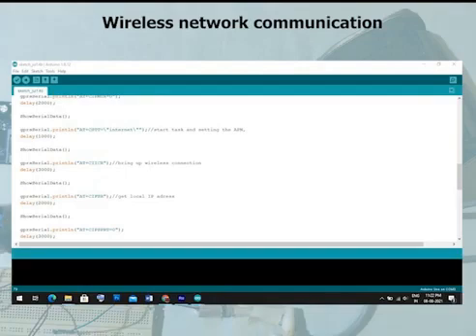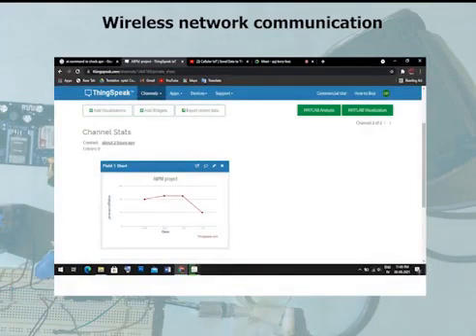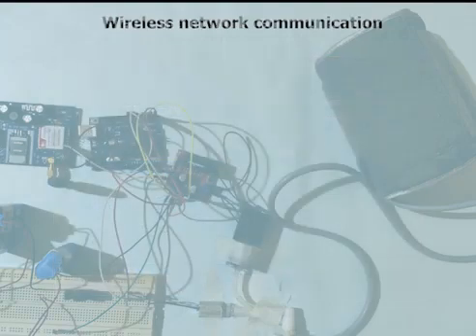Next step is we set the network to obtain the IP address, and finally we have inserted the API write key of ThingSpeak so that the data coming from MCU gets displayed on the cloud server. This is the code being executed and sent to display on ThingSpeak. The data which is sent by GSM is displayed in a graphical manner on ThingSpeak. The pressure readings are in unit called PSI and the time is in seconds. After every 6 seconds, the pressure sensor gives the pressure reading.